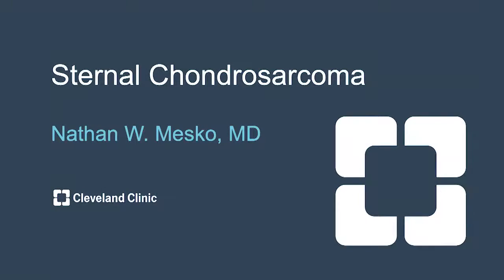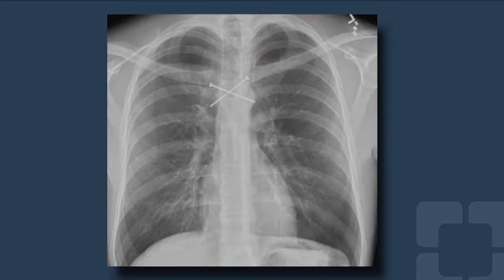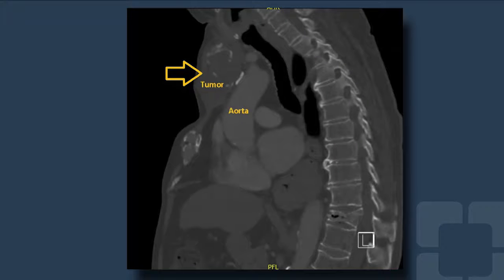This case involves a gentleman in his 70s who had undergone multiple resections of a sternal chondrosarcoma, which unfortunately had recurrences after each resection. He presented with a multiple recurrence that essentially forced us to remove 70% or so of his sternum bone, and a portion of the medial clavicle anatomy was also involved. The unique challenges of chest wall movements, the critical anatomy living immediately behind the sternum, such as the heart, and the limited bone fixation created one of the more impressive challenges that I've encountered in my career.